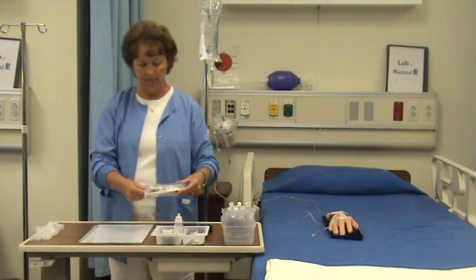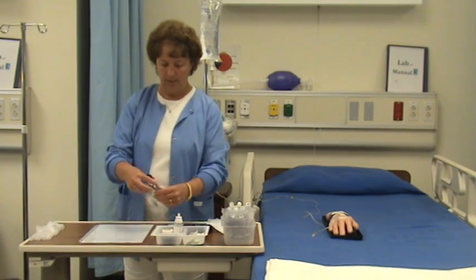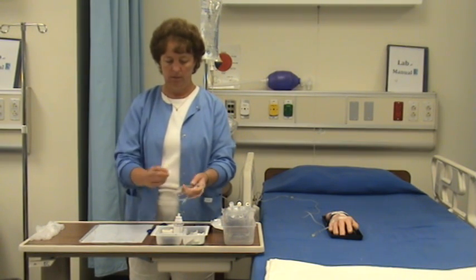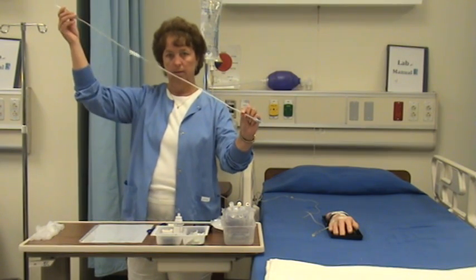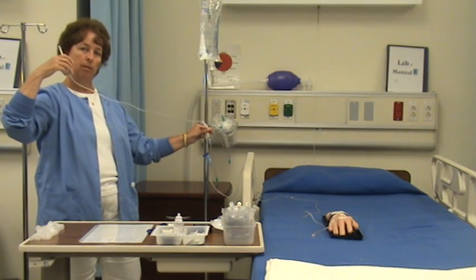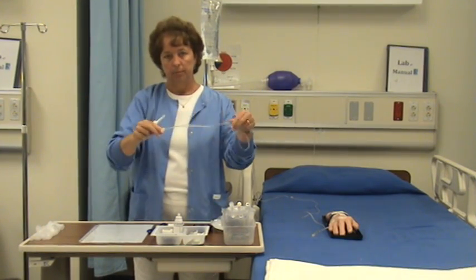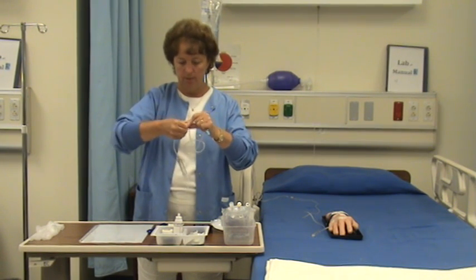So I'm going to open my tubing. And your secondary medication tubing is short. It's not like a primary tubing, it's a shorter tubing. Because it's actually going to be plugged in at the port closest to the IV bag when you go into the patient's room. So it's a short tubing. First thing I do when I open it up is remember that closed spike squeeze. Take the roller clamp, close it.